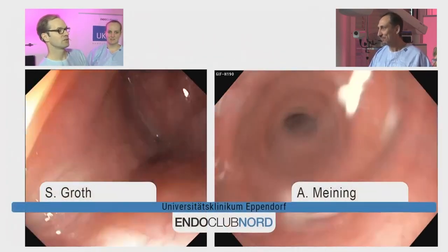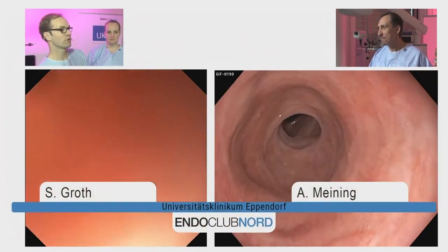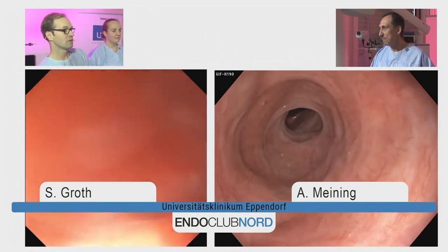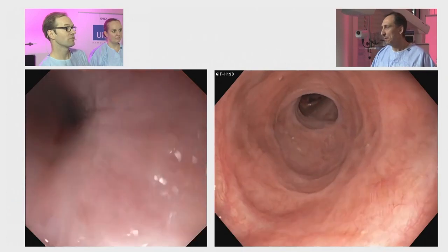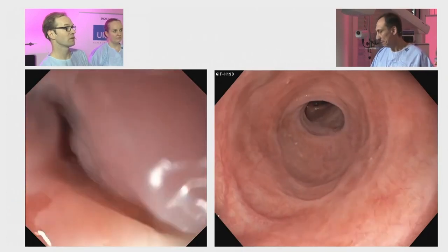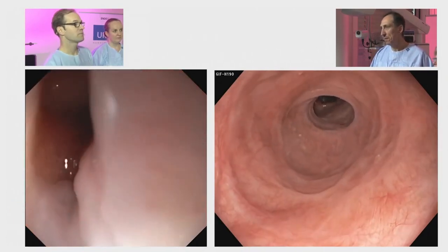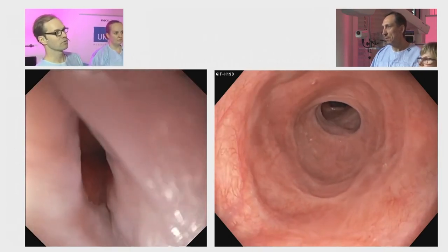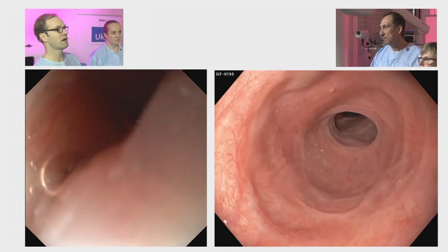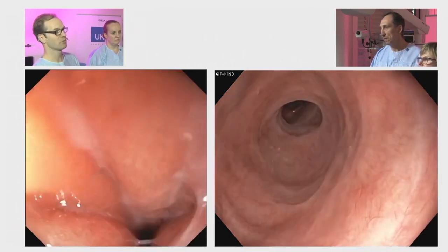We're going in here just now. Here's the glottis, and here you can see the upper esophageal sphincter that we're going through. We can see the distance to the stenosis — it's around 6 or 7 cm that we can go down. I've got an XP190N, with an outer diameter of just under 6 mm, and at that thickness I've still got some resistance as I go through.